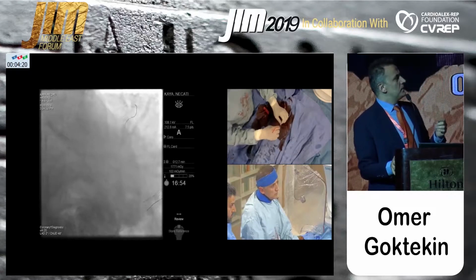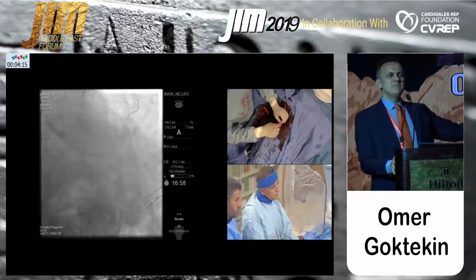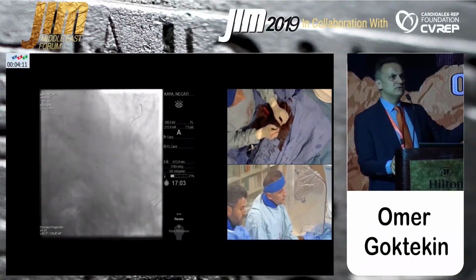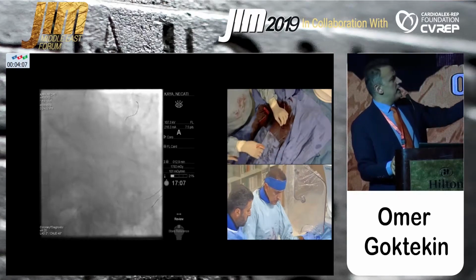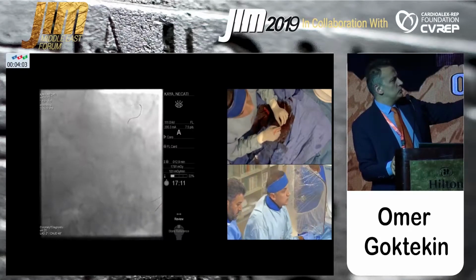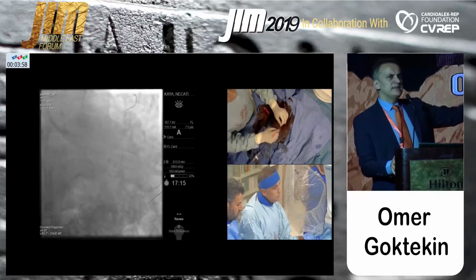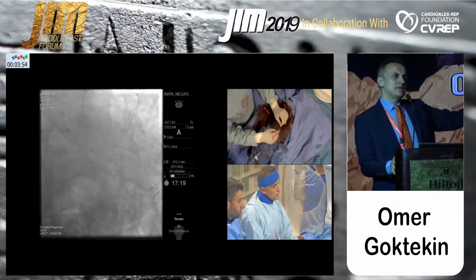In here, if I put a stent in that small OM, then I could do mini crush technique here, which is the best and I think the only solution. I cannot do culotte, I think. So anyhow, we put a 2.5 by 38 stent and we park that balloon at the OM. What we will do, we will inflate the stent and also we inflate the balloon and we will do kissing.